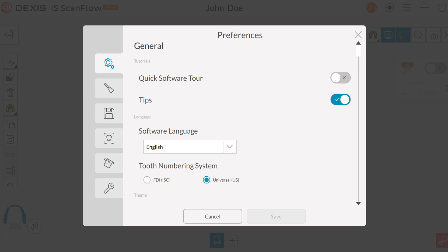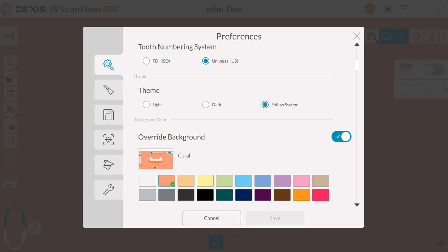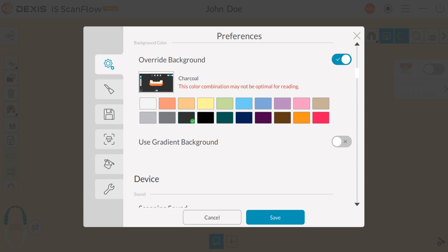Here are the preferences used daily. Under the General tab: Tips — toggle on or off to view tips for certain features. Software language — click the drop-down arrow to choose your default language. Tooth numbering system — select your preferred system. Theme — choose light, dark, or follow system. If you desire a contrast between background and button colors, enable override background and choose your background color. A warning message will be displayed if your color combination is not optimal for reading.